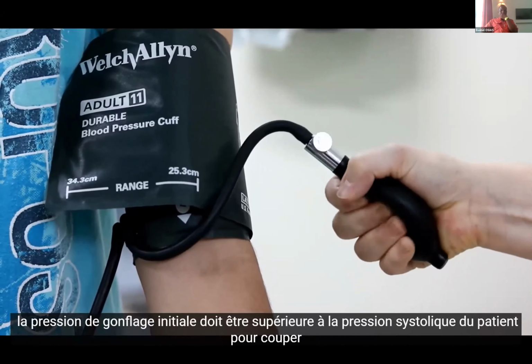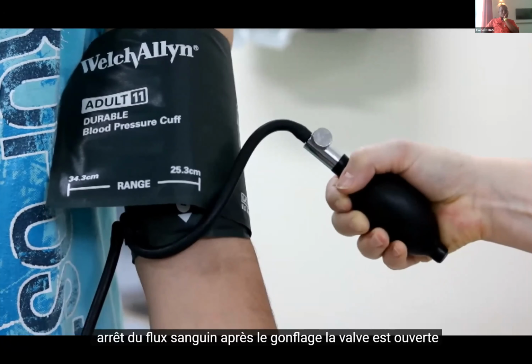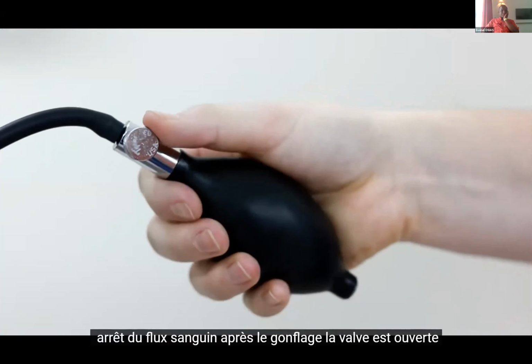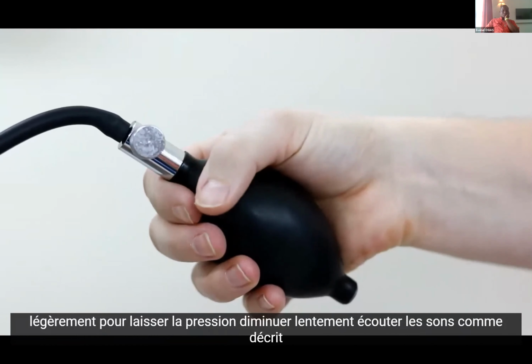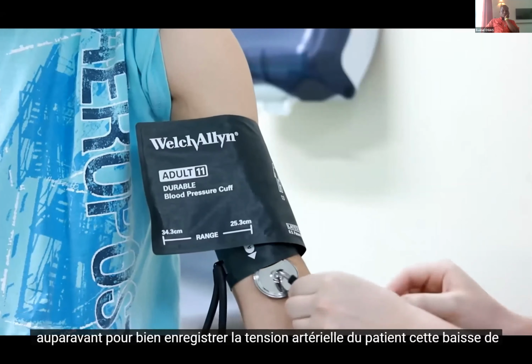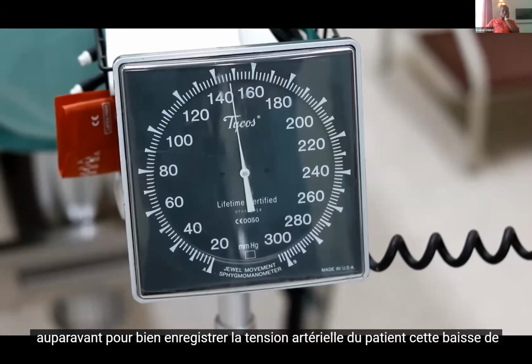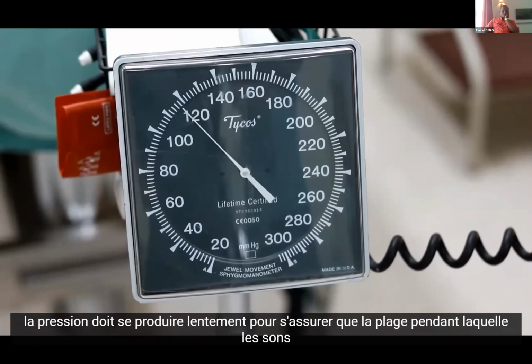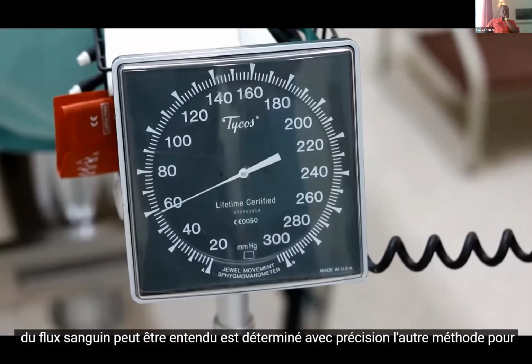The initial inflation pressure must be above the patient's systolic pressure to cut off blood flow. After inflation, the valve is opened slightly to let the pressure slowly decrease. Listen for sounds as described previously to properly record the patient's blood pressure. This drop in pressure must occur slowly to ensure that the range during which the sounds of blood flow can be heard is accurately determined.